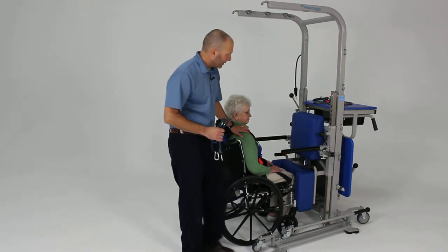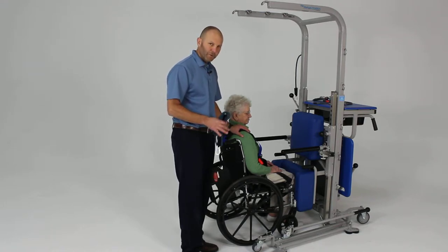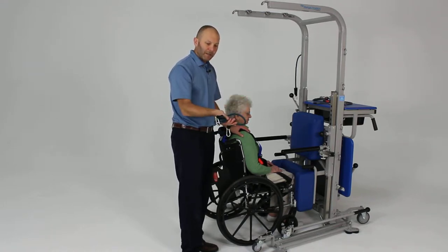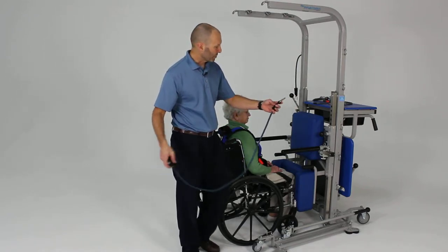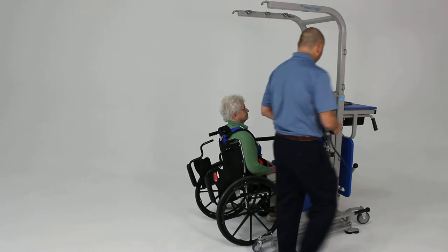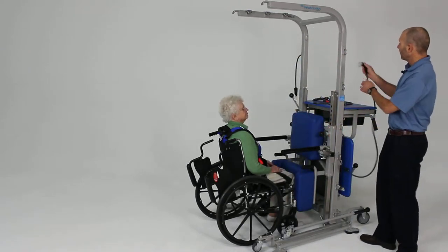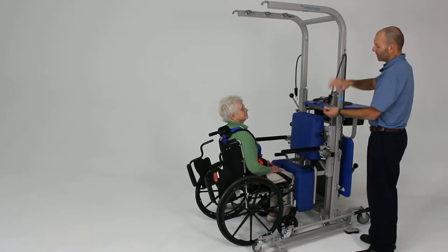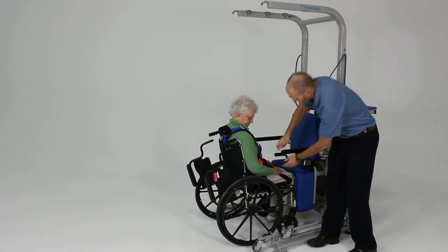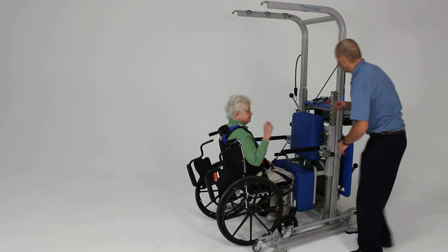This person is having difficulty getting out of the chair under their own power, so we're going to use bungee-assisted bands to help assist with the sit-to-stand motion. We're going to clip this into the number four clip point, run it through the number one clip, and anchor it down onto the pelvic support strap at the D-ring attached just underneath the hips. We'll do the same thing on the other side.